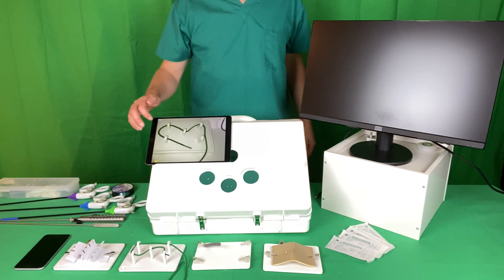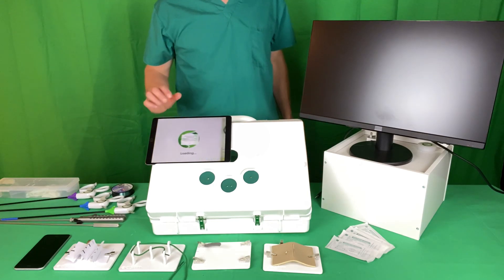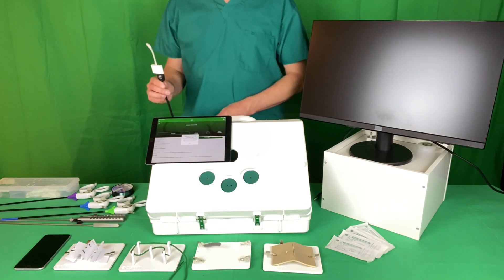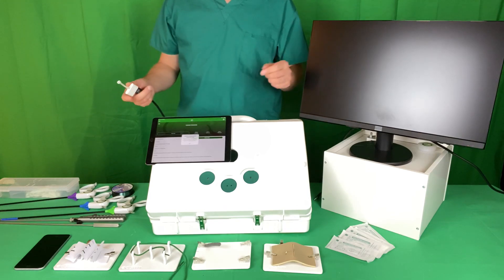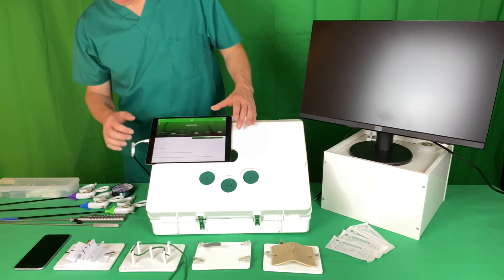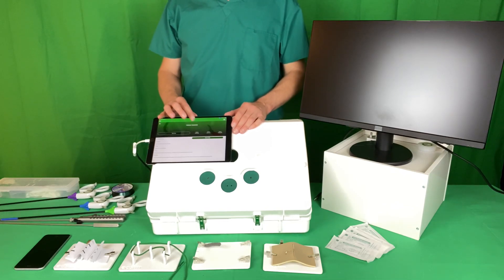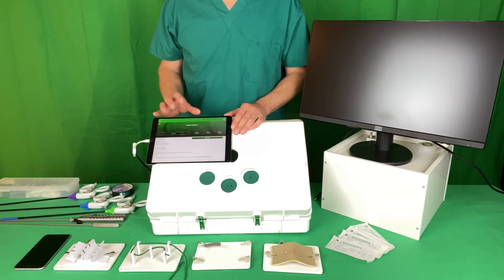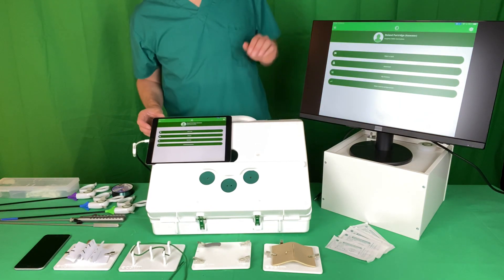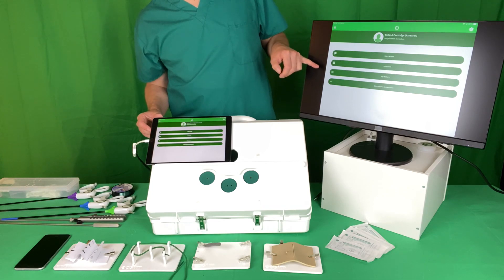To demonstrate the SurgeTrac software I am going to plug it in with a lightning to HDMI adapter, and you'll be able to see what's going on on the screen when it loads up.